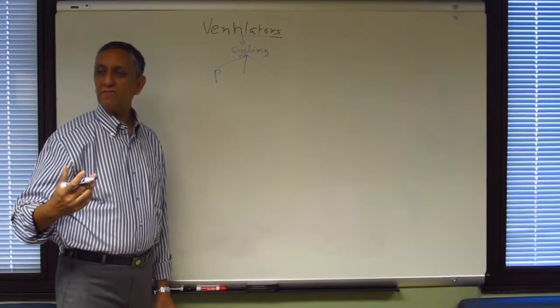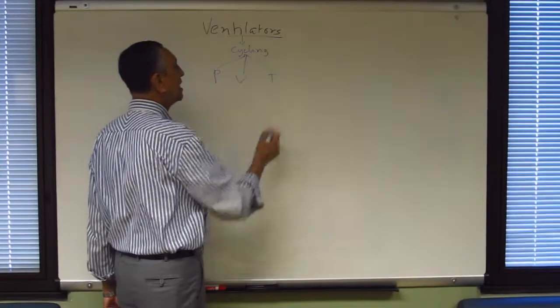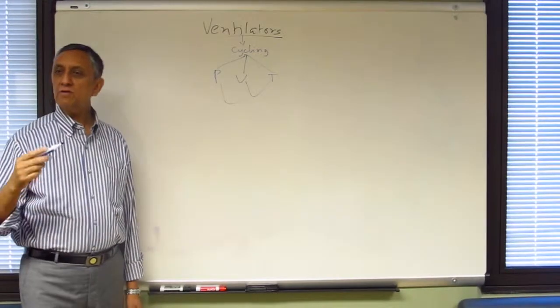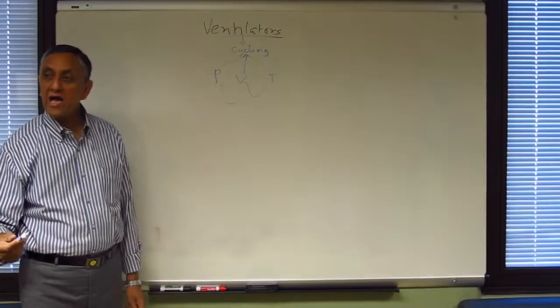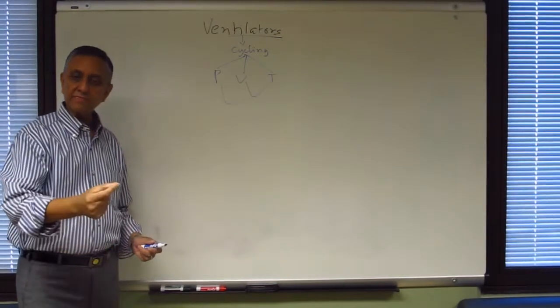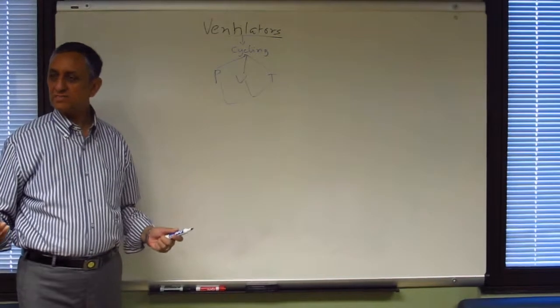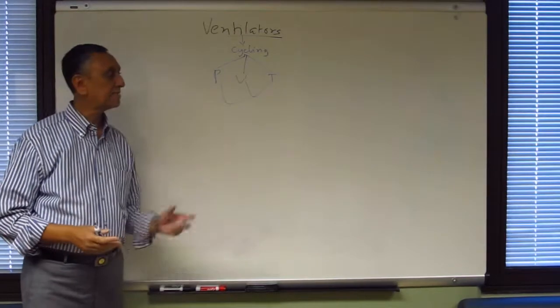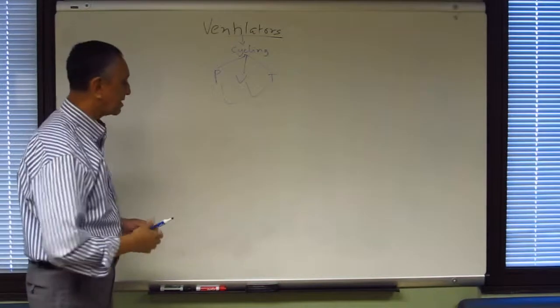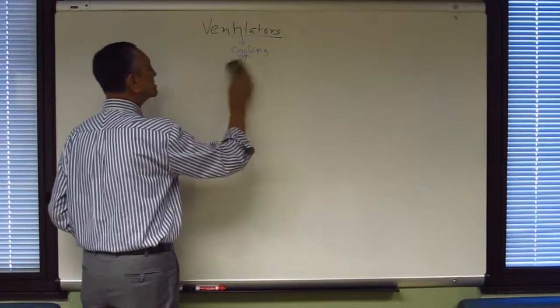What's the most common way we ventilate a patient? Volume. Pressure, volume, and the third is time. At any given time, there has to be a combination of either pressure and time or volume and time. Because let's say you have volume 700, the machine will go and at 650, all of a sudden there's a small leak. It cannot reach 700. Then the machine will just stop, basically. So that's why there has to be time when it will cut off and the machine will start alarming to get our attention. So its commonest mode is volume and time, and pressure is another one.